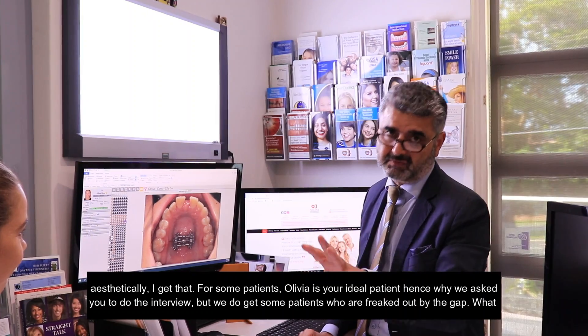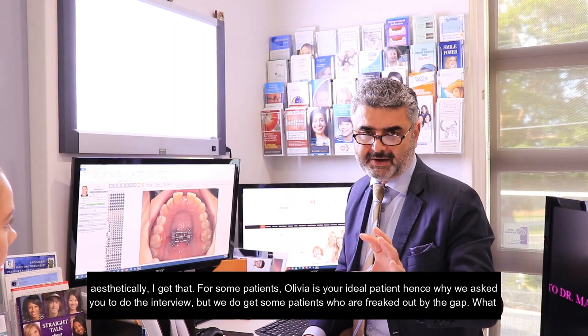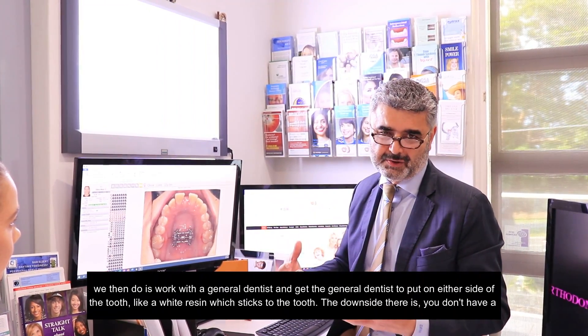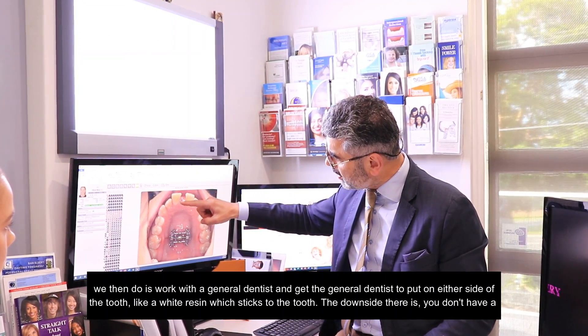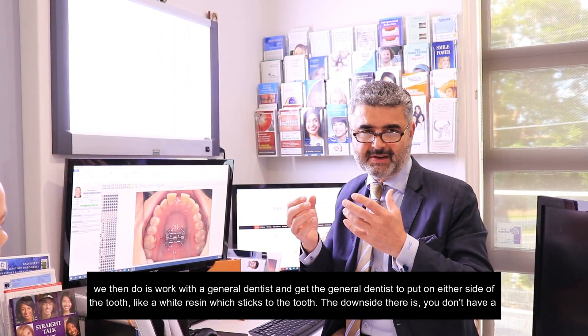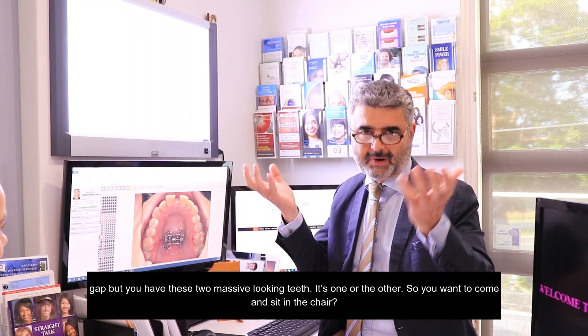For some patients, we do get some who literally freak out by the gap. So what we then do is work with their general dentist to put on either side of the tooth a white resin which sticks to the tooth — the downside there is you don't have the gap between the two teeth. So it's one or the other.